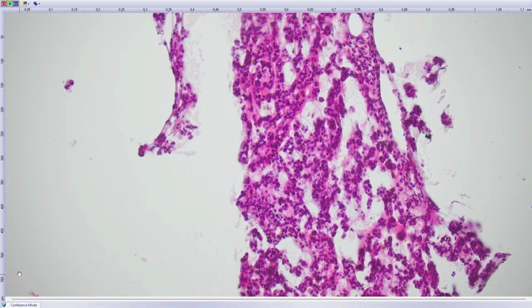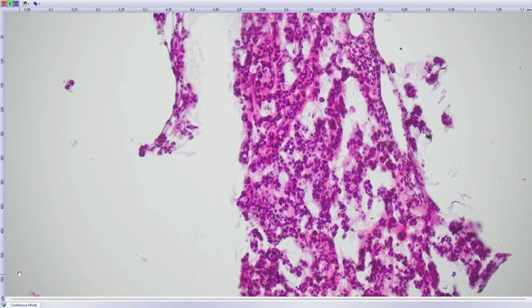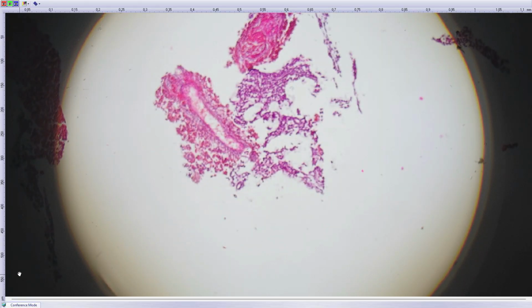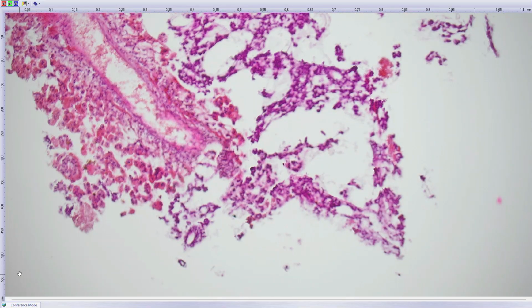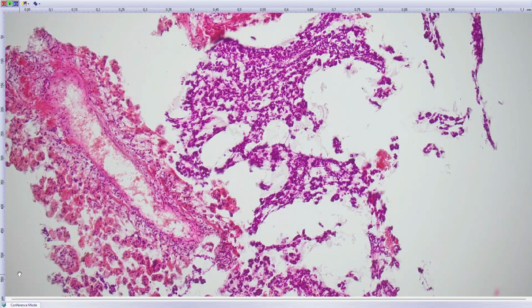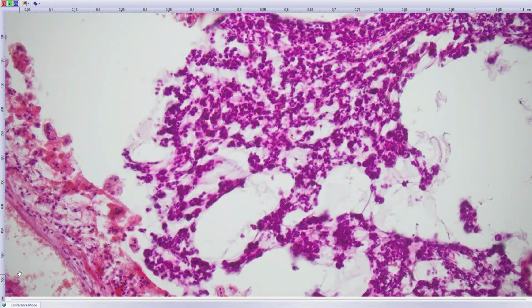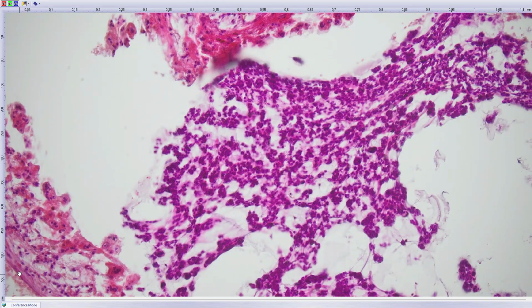And H&E is not very nice here. It was probably something wrong with the biopsy in the referring department, but we can see it's something set in myxoid stroma with trabeculae of roundish cells, and these 13 years ago showed some EMA positivity and S100 positivity.